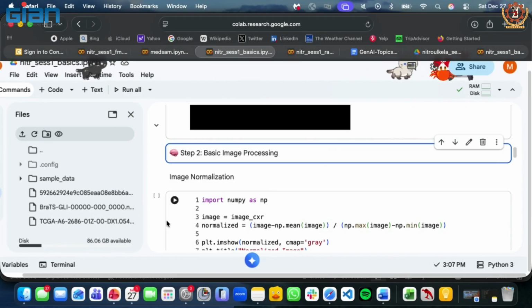No, generally no, because they are of different thickness. There can be different dose because different patients have different dose levels. For example, to see where the tumors are, you will use a high dose CT. For a person who has recently gone through chemo, you don't want to add any additional radiation in the body, so you will take a low dose CT. There is a dose variance, there is a slice variance.